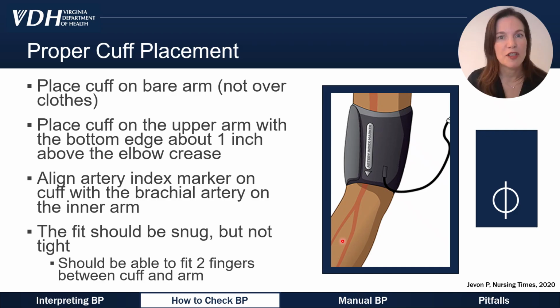And the fit of the cuff should be snug but not tight. When the cuff is deflated, you should still be able to fit 2 fingers between the cuff and the arm.